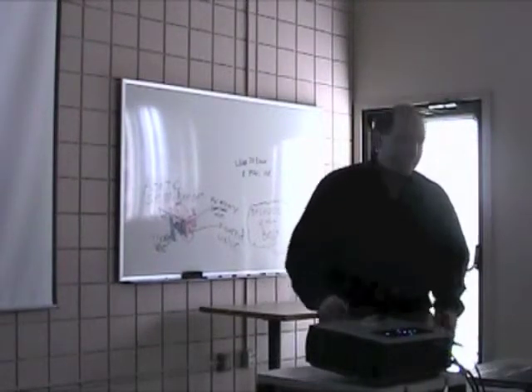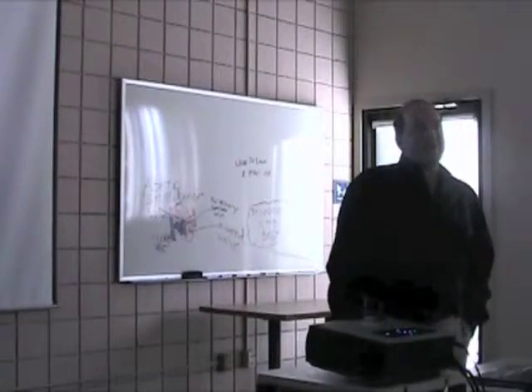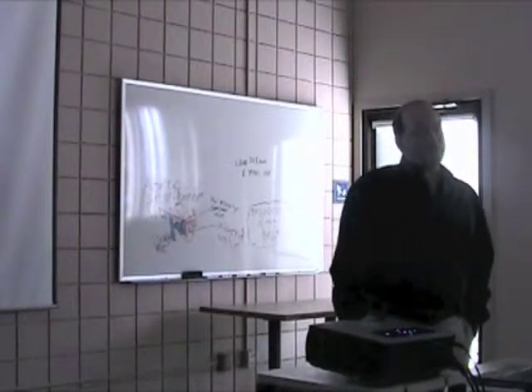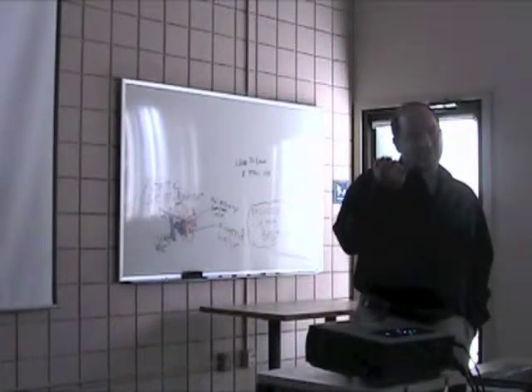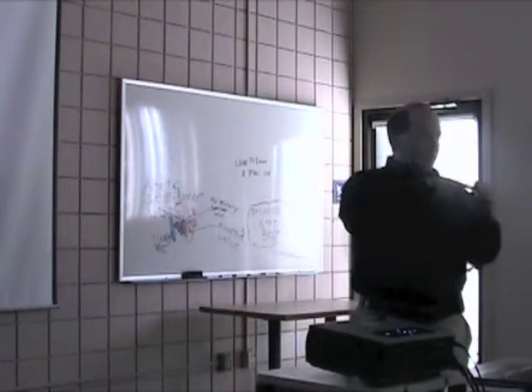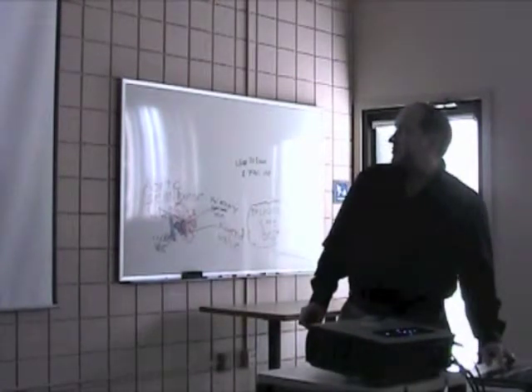What is the actual size? So the most common valve that we put in is a 23 or 21 millimeter valve. So about the size of your pinky or maybe your index finger for the center of it. And that varies a lot from person to person too.